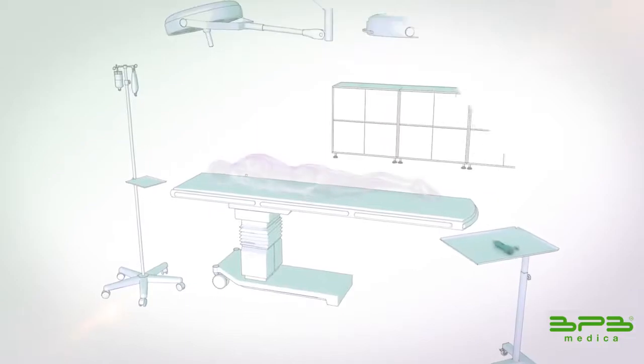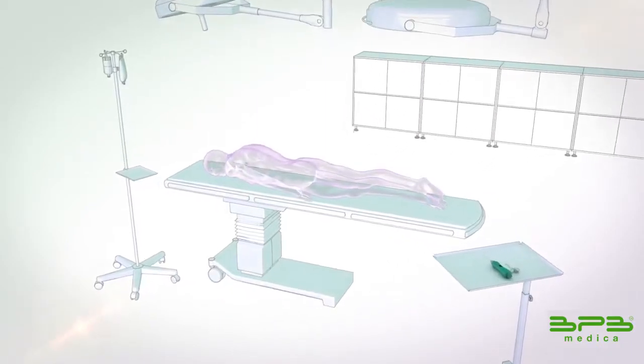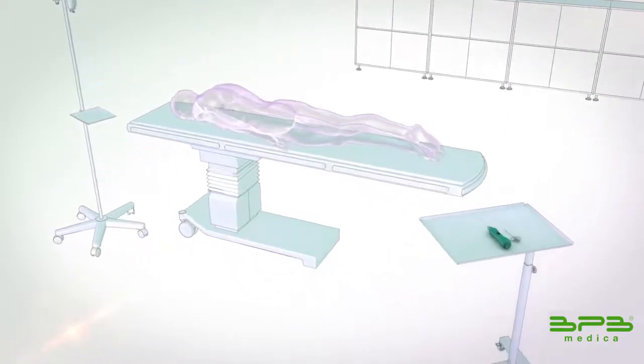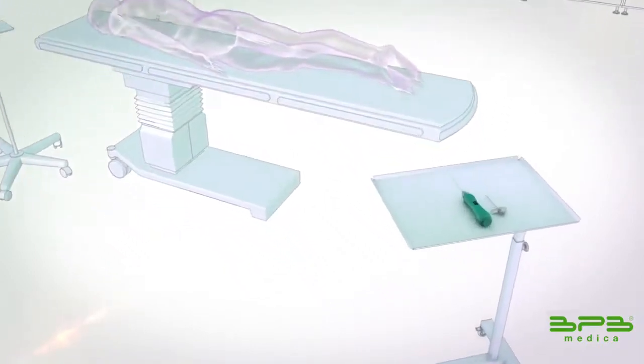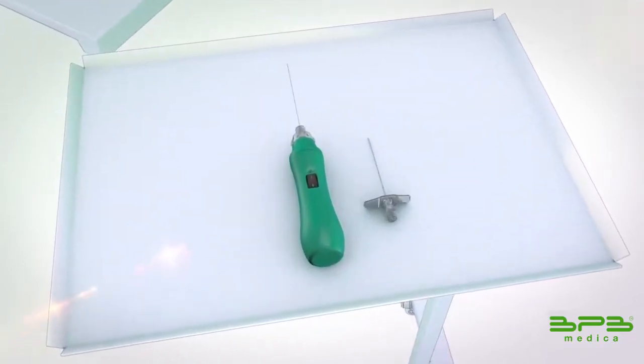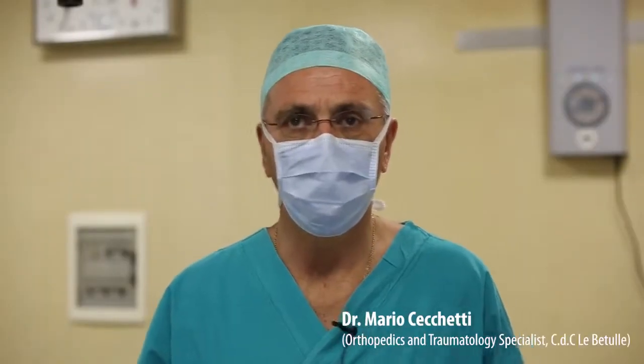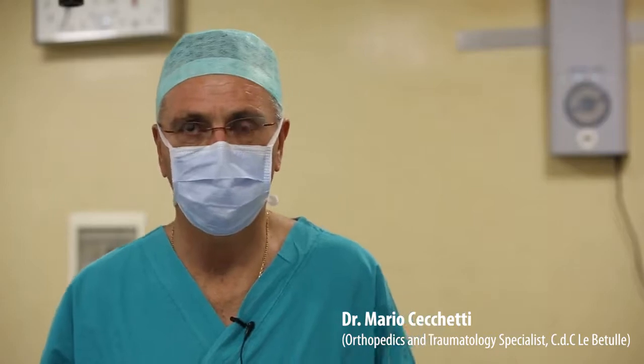Position the patient in hyperextension position under fluoroscopic guidance before proceeding with anesthesia and device preparation. Using the DISKOM device, spinal specialists can reduce the pressure on the nerve root by removing the nucleus with a minimally invasive procedure. The patient has a long history of severe left lumbar sciatica pain.